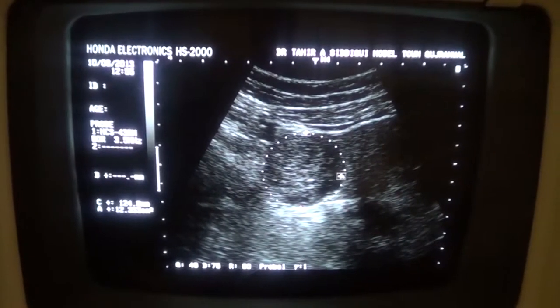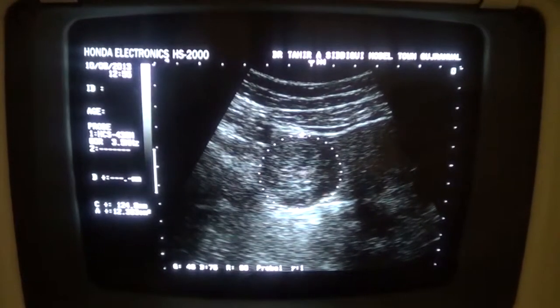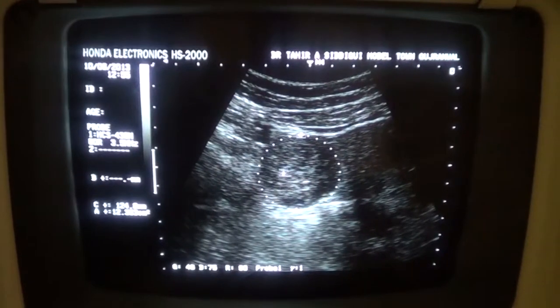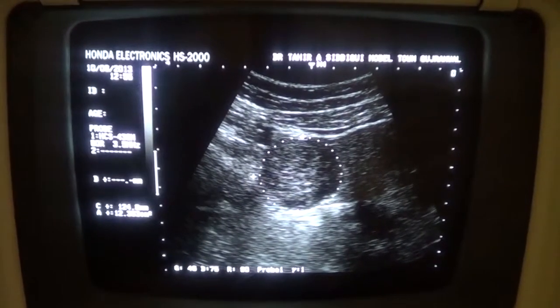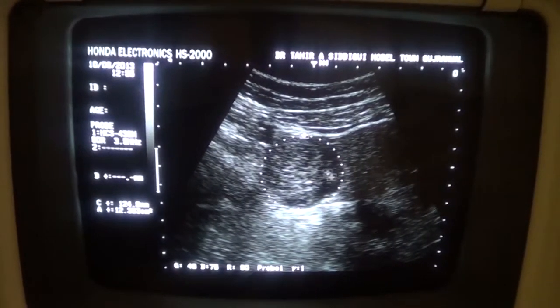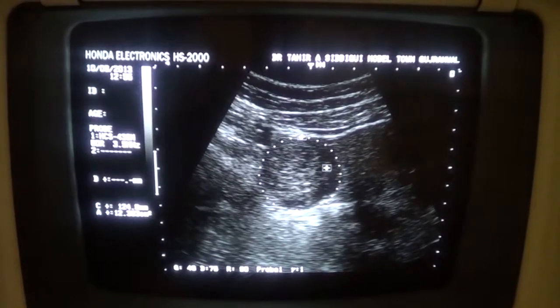Now this is a scan from a different plane, where the same cystic mass is now appearing both cystic as well as solid. Now this solid echogenic area within the cyst has multiple tiny cystic areas within it, and if I had Doppler, to me it appears to be a vascular sort of a mass with these tiny cystic structures suggestive of vessels within this cystic mass. And at the medial margin you can see fluid with echogenic areas within it.